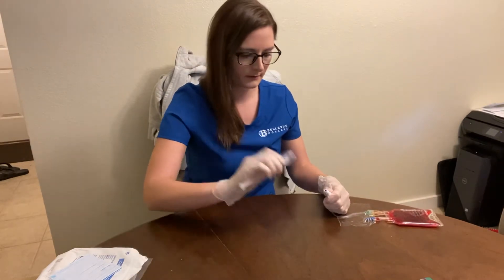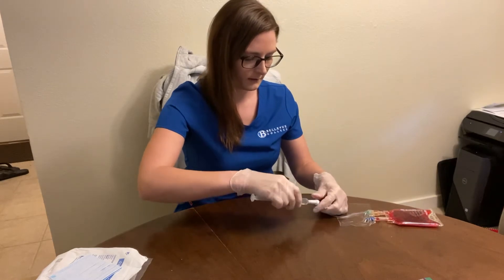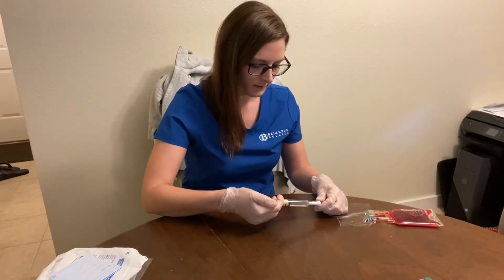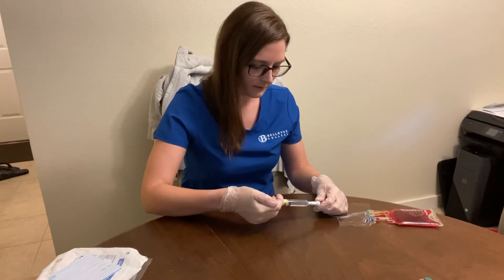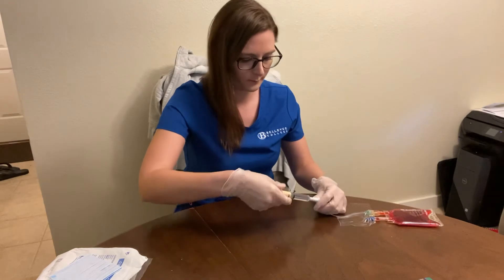I'm going to get my heparin and do three ml of heparin — two ml in, two and a half in, and then at the last half ml, I'm going to clamp while I put it in.